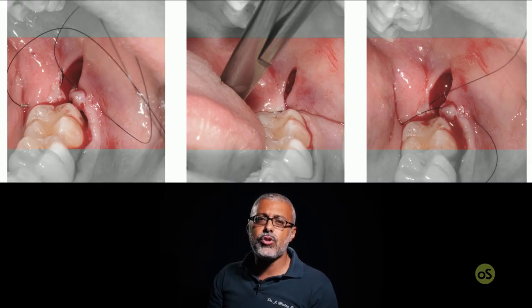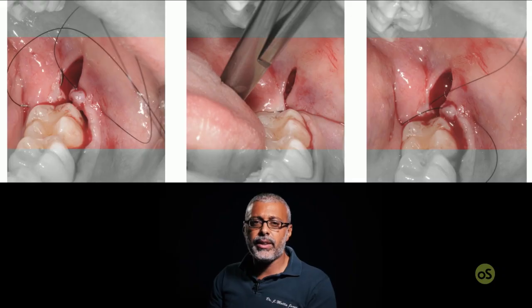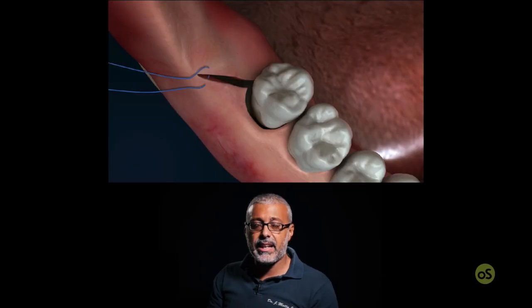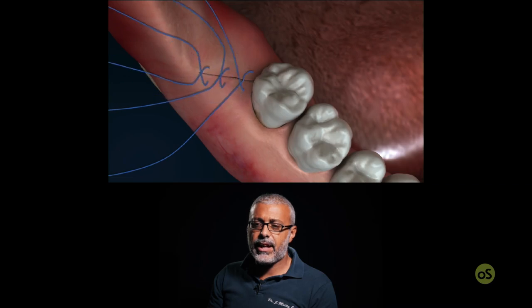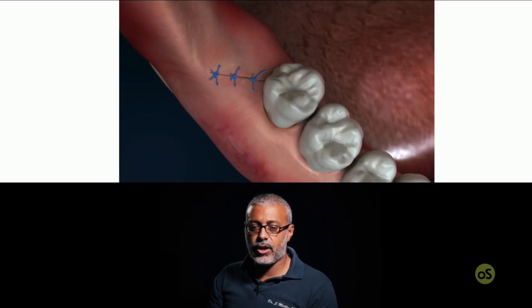And then I will close my releasing incision with single sutures, as I can show you in this animation. You see single sutures and then a mattress suture to close the distal aspect of the second molar, but we will see this in detail in the clinical cases.